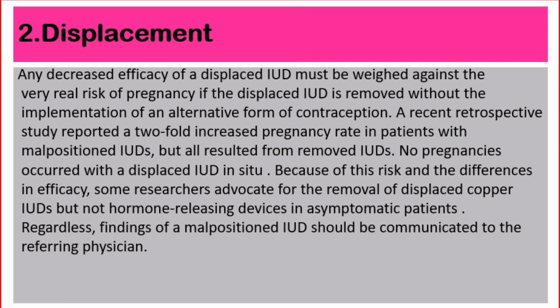Because of this risk and the differences in efficacy, some researchers advocate for the removal of displaced copper IUDs but not hormone-releasing devices in asymptomatic patients. Regardless, findings of a malpositioned IUD should be communicated to the referring physician.